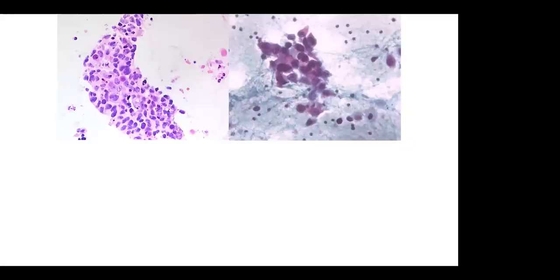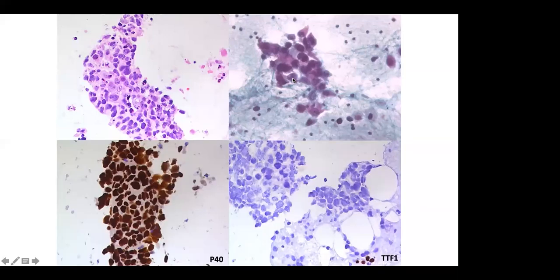Look at this case. So this is a transbronchial fine needle aspiration. You have a cell block. You have the cells on your right side. So how do you classify? Adeno or squamous? Okay. Sometimes it looks like the cytoplasm is a little bit red, maybe some keratinization, nucleoli sometimes look visible, difficult. So the immunohistochemistry in cell block showed that this is a squamous cell carcinoma. P40 was strongly positive. TTF1 was negative, and here you can see an internal control.